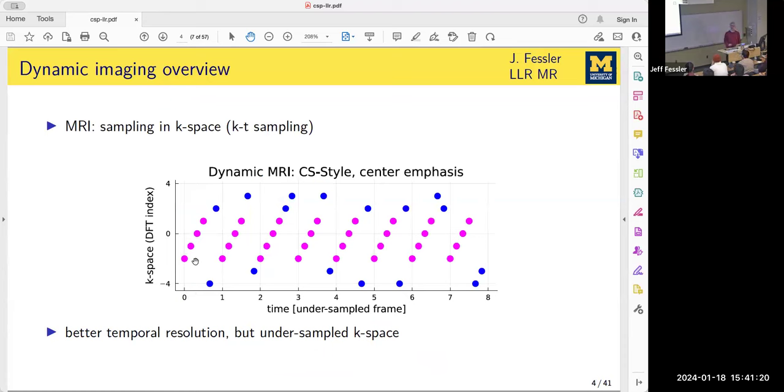Yes. We are collecting the samples as fast as we can. There are both physical limits of the patient and hardware limits of the scanner. It's partly amplifier limits on the scanner, but even if we built more powerful amplifiers that could swing these gradient fields at faster rates, it can cause peripheral nerve stimulation that people don't like. So there are limits, both hardware-wise and wetware-wise, on how fast we can sample per second, basically. That's a simplified version, but there are serious limits there.